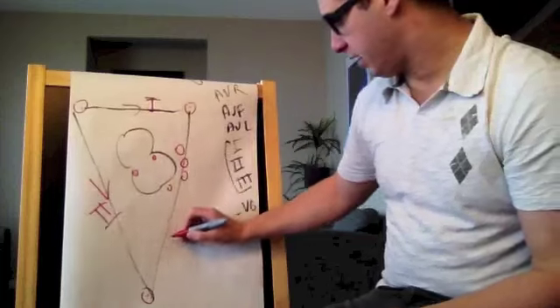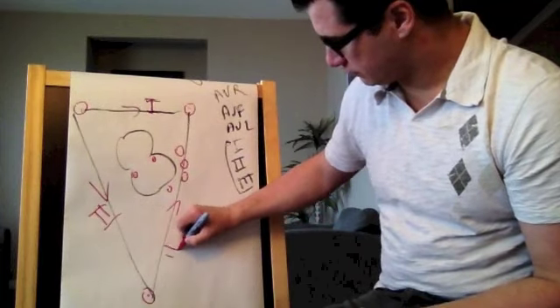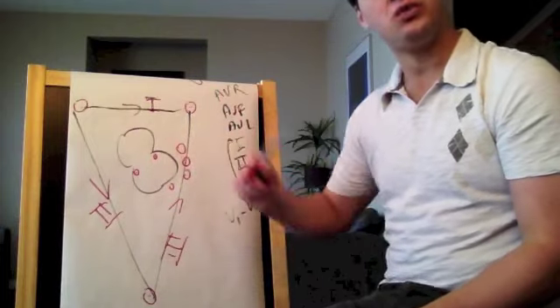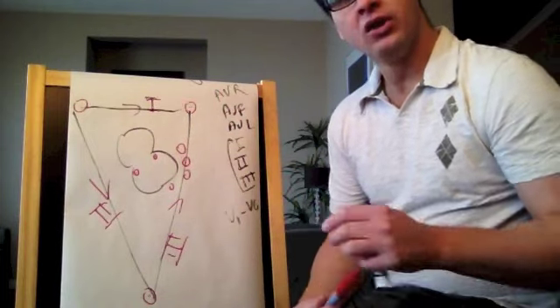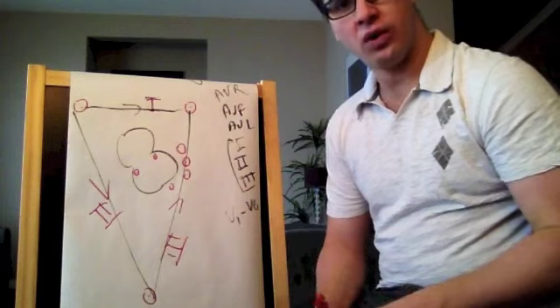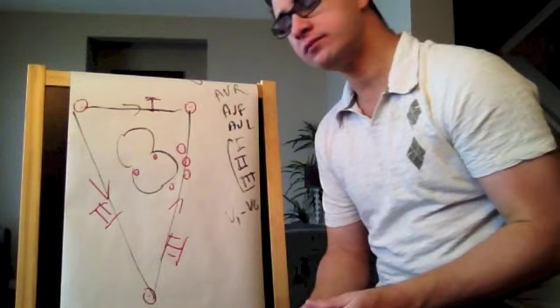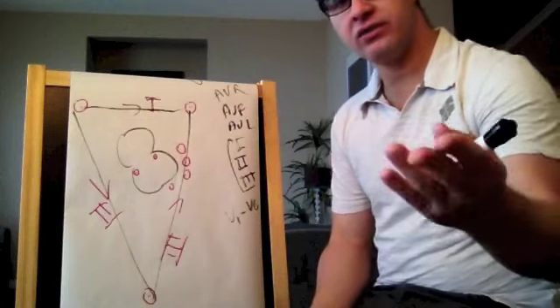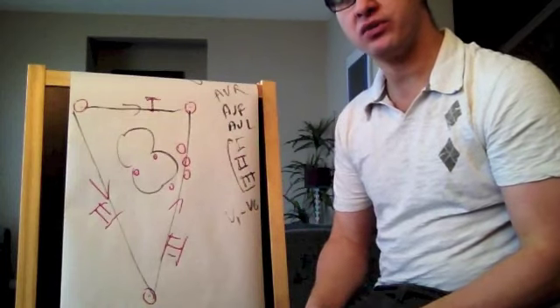And lead 3 will read the electricity this way. So if you would look in a 12 lead, during those videos, it would be a good thing maybe to have a picture of a 12 lead and stuff.